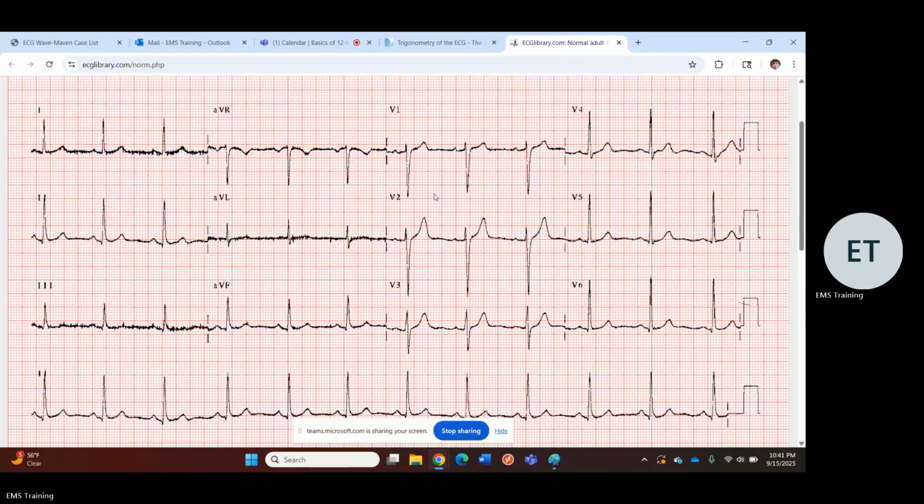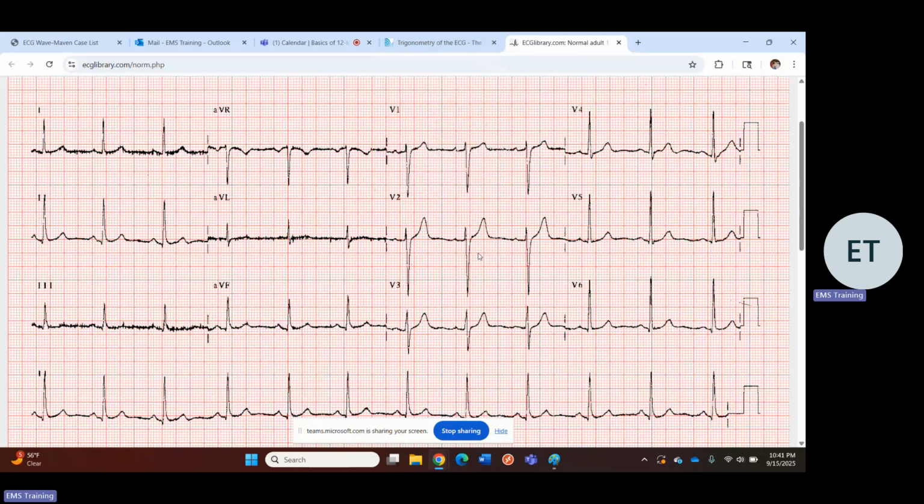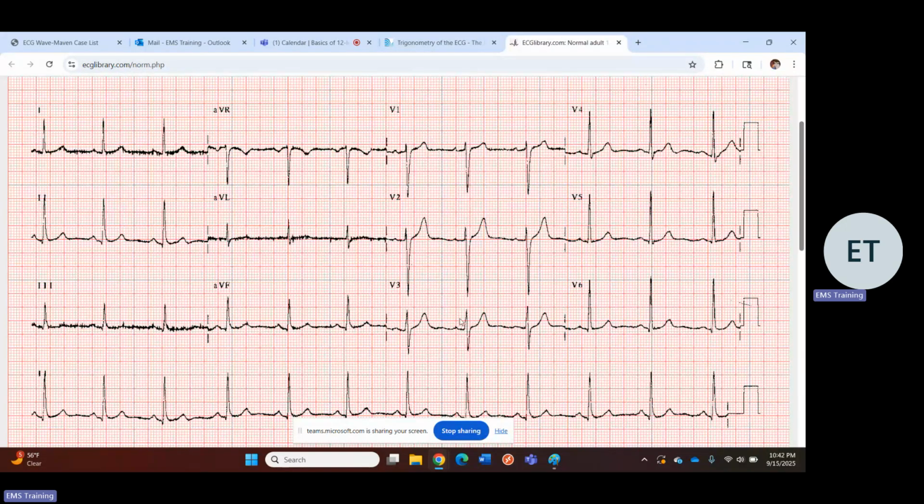And then I do the axis on every single EKG as a basic principle. So I would recommend doing that. Remember, I said that it switches somewhere around V3, V4. Half the electricity is going towards it, then half away. So it should be 50-50. Around here, it should be primarily negative, negative, 50-50, positive, positive, positive. So in this EKG, the R wave transition is normal.